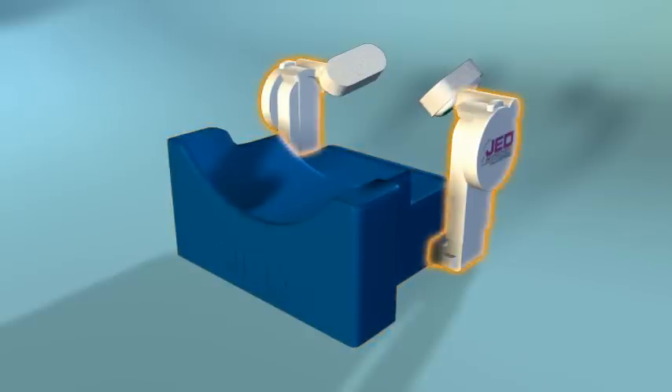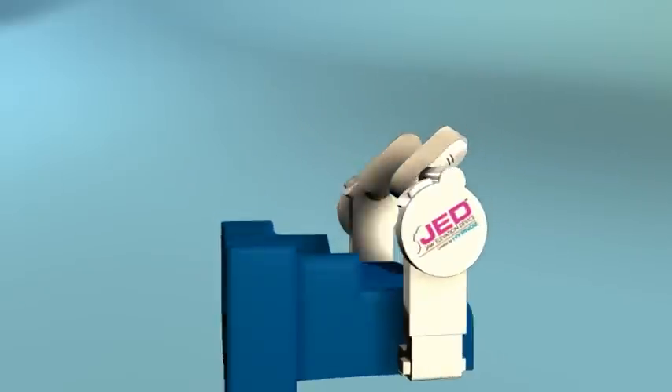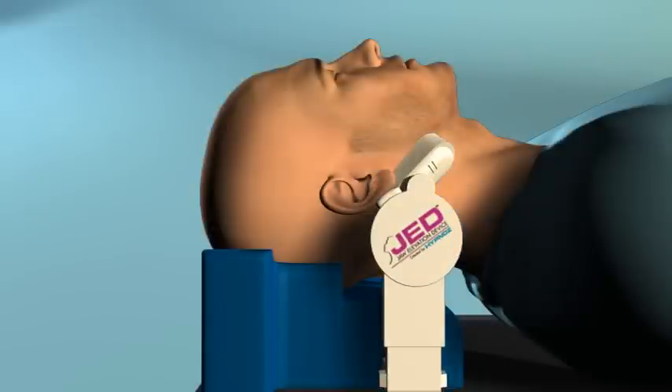A three-way adjustable apparatus allows you to position and hold the patient in a comfortable sniffing or jaw thrust position. Disposable foam mandible cups are positioned at the angle of the patient's mandible, allowing manipulation of the jaw during the procedure. The soft foam material is designed to cushion the mandible, dissipating pressure on the patient for the duration of the procedure.